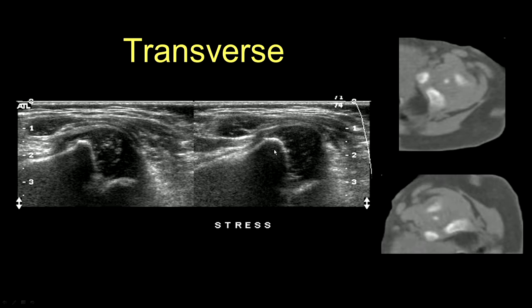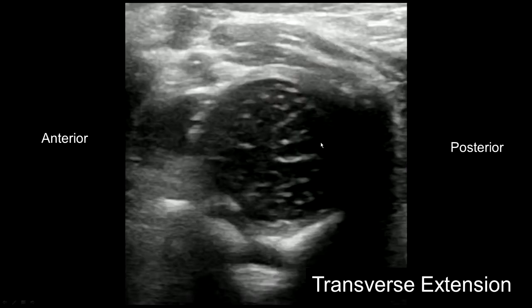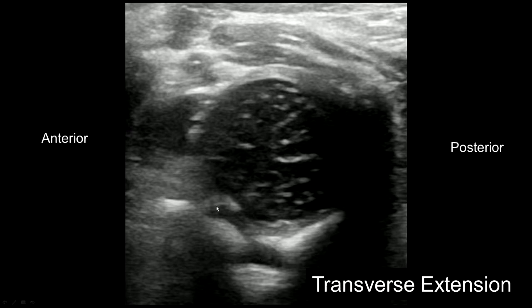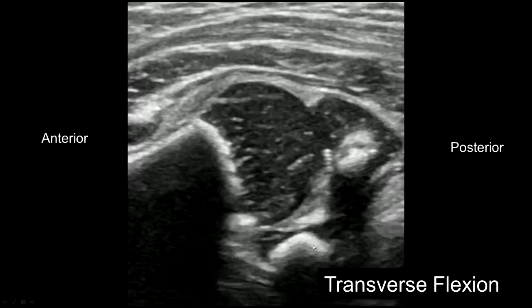In this case, we've used a stress view where we've pushed the femoral head posteriorly to see if there is instability. This is an image in extension, similar to the CT I showed you. Again, this is anterior, this is posterior, this is the pubis, this is the ischium, and the femoral head should be nicely seated in the hip concavity.